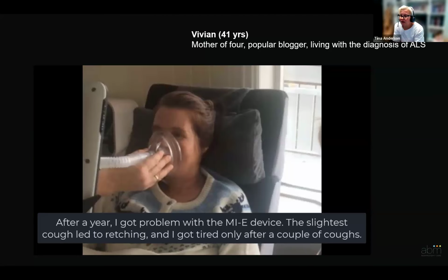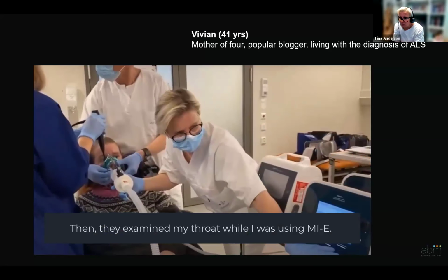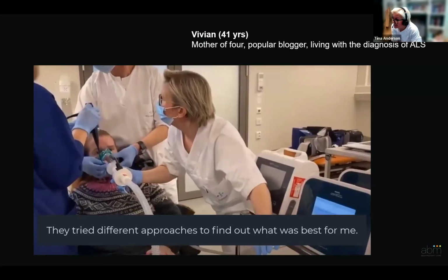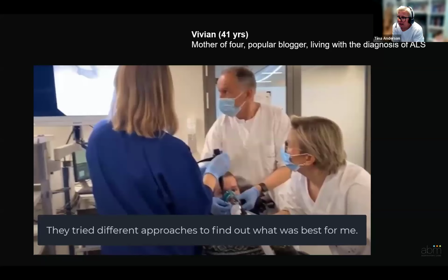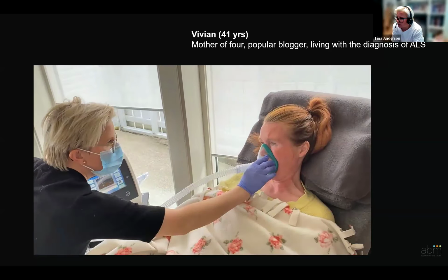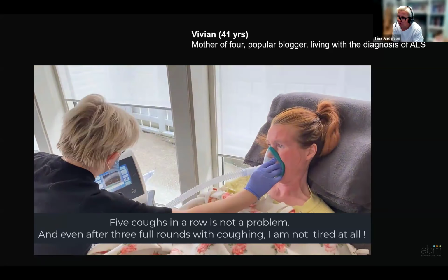But after 1 year in home use, she got problems again. We tried some other settings, didn't work. So we decided to visualize her upper airways. We tried a little bit different devices because we have seen that there are differences from device to device. And we managed to find a treatment that was not causing any retching, which was her problem, and she could calmly get help from MIE treatment further.